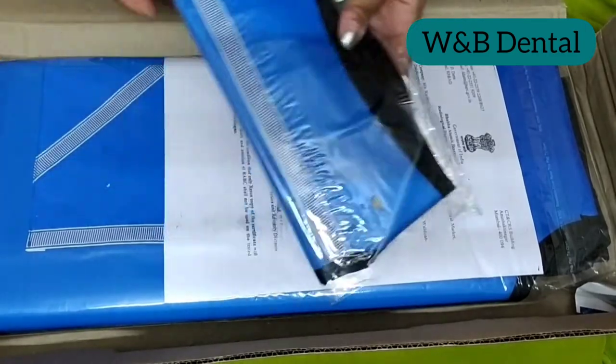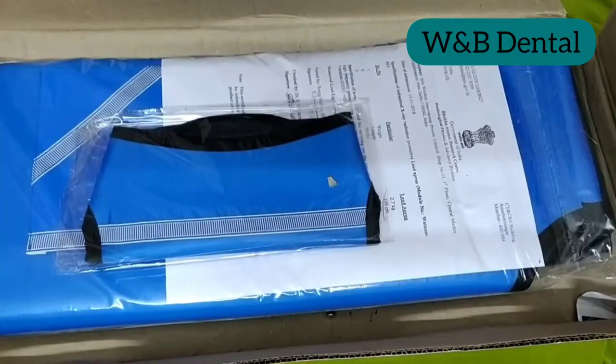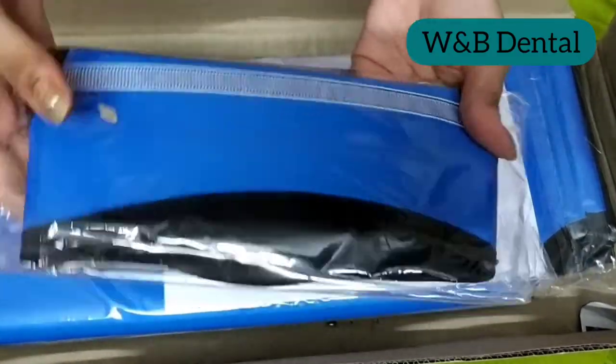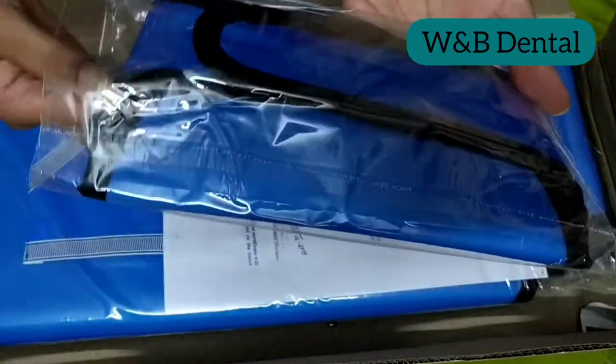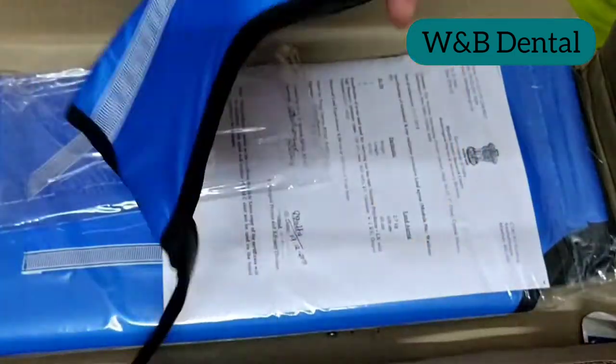It is BARC certified. This quick, easy-to-use thyroid shield collar is a type of apron specially designed to protect the thyroid gland from exposure to X-rays during dental imaging, as it is most vulnerable to X-ray exposure.